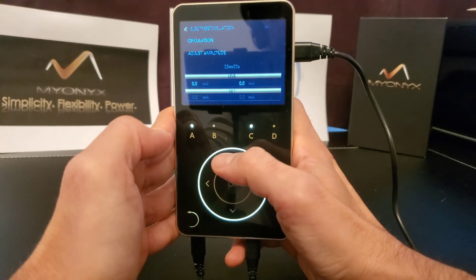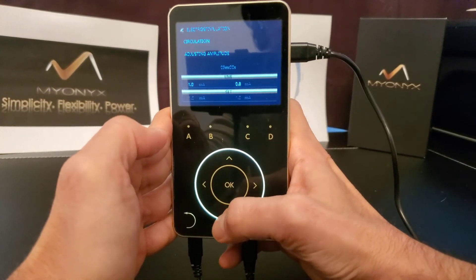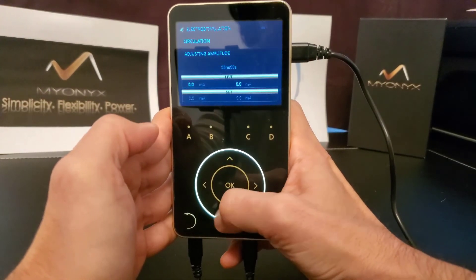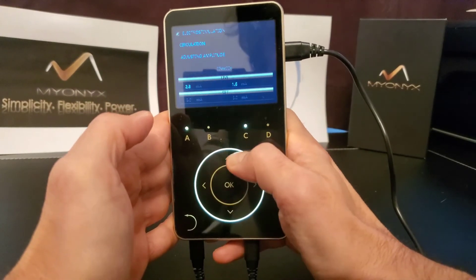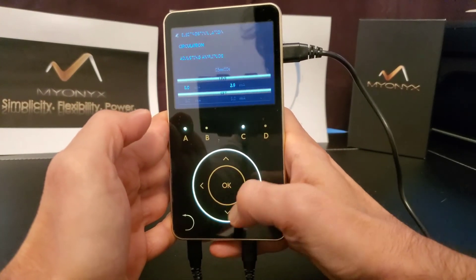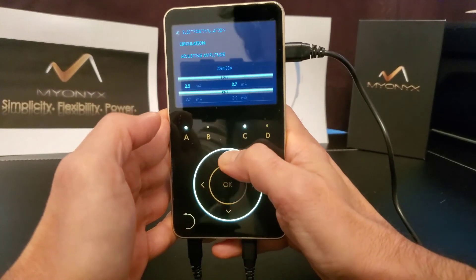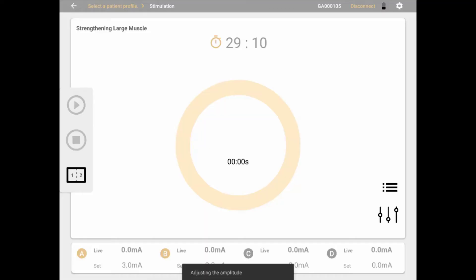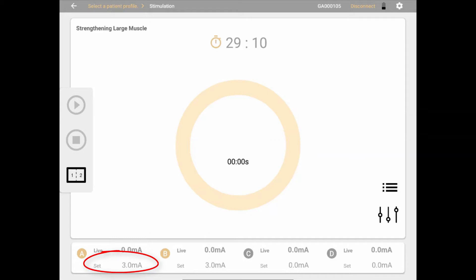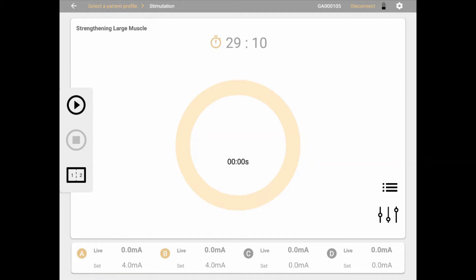Then, use the up or down arrows, or use a circular swipe motion, to increase or decrease the amplitude. Stimulation will be administered and felt by the patient as you adjust the amplitude, and the level will be displayed on the Mionics device and in the app. When done adjusting, amplitudes will be saved as set values, and live values will go back to zero.